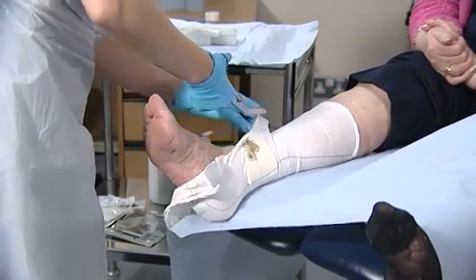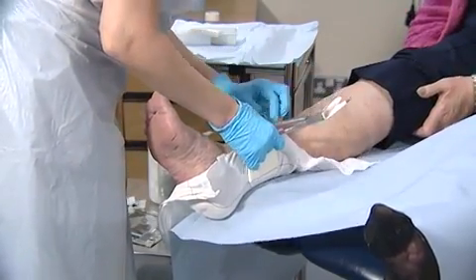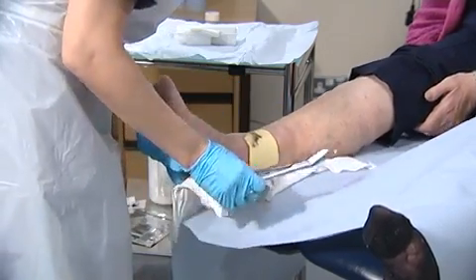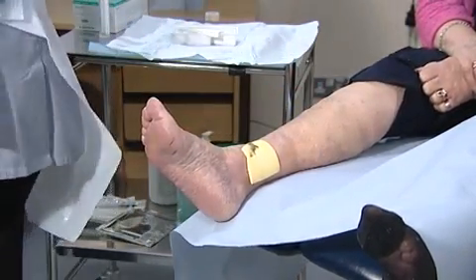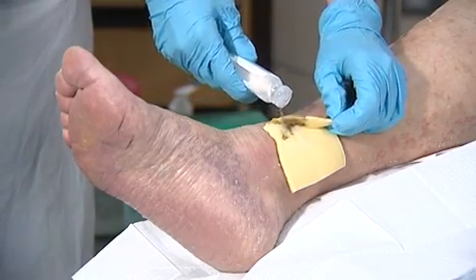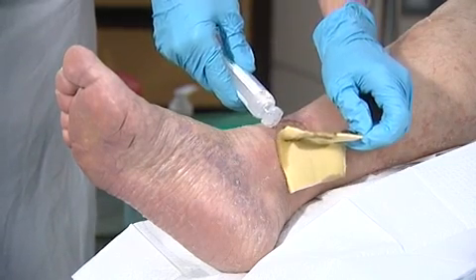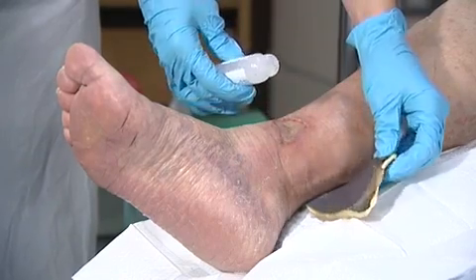Carefully remove the retention bandage or tape used to secure the dressing. Gently lift the edge of the dressing, using Prontosan solution to loosen the dressing if necessary. Discard the old dressing.